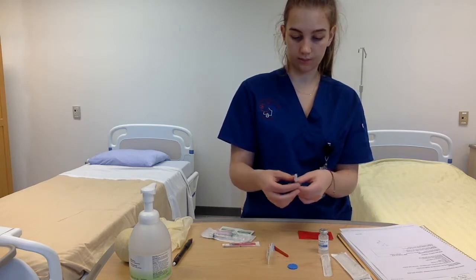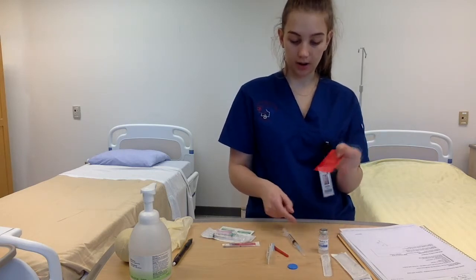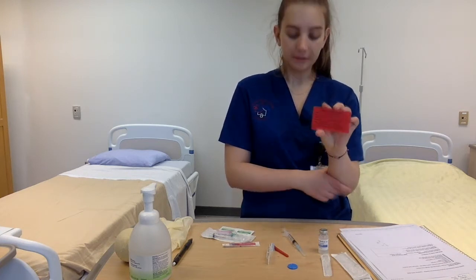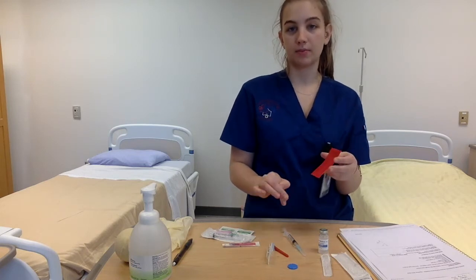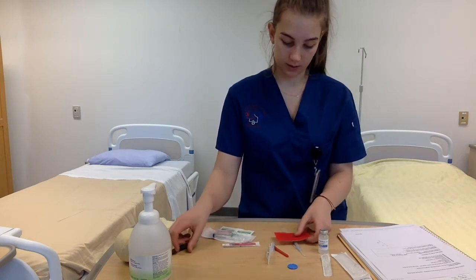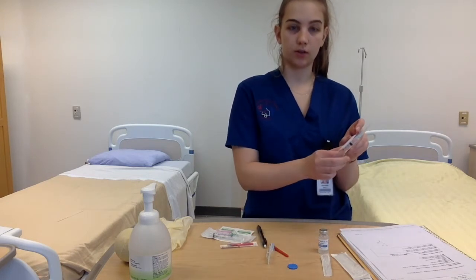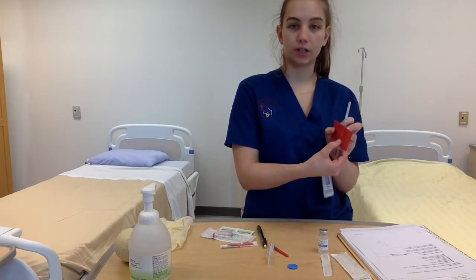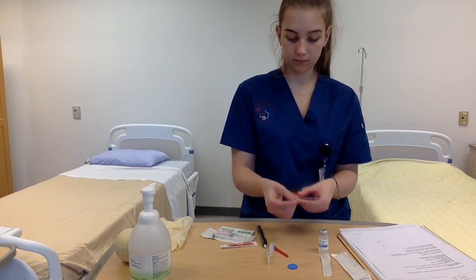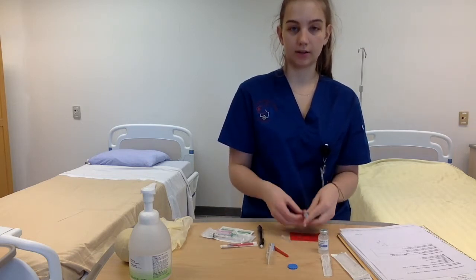And then I can leave the cap on while I'm writing down the medication label that I'm going to put onto this medication. So this one just has all the patient's information on it. And this is important because, especially because I'm giving 2 injections today, I need to know which medication is which. So I write down the information and then just attach it to the syringe like this. And then after I'm done that, just take off the cap carefully. And then this needle is ready to give to the patient.